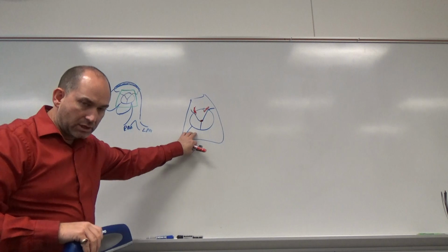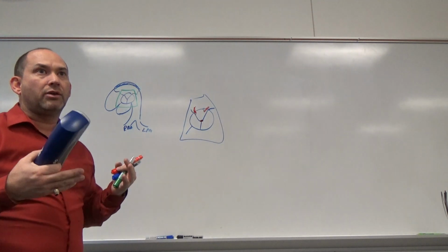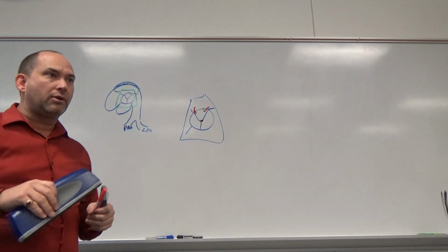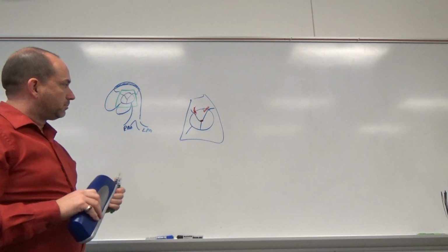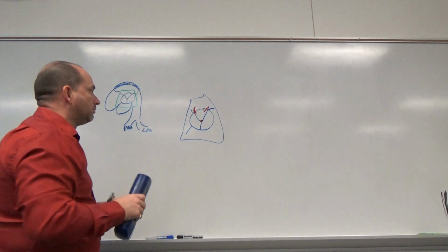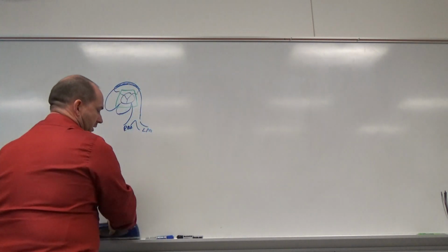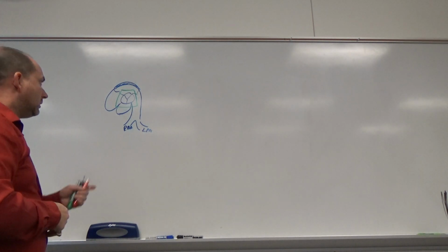So 2D clip of the aortic valve, we're looking for calcifications, thickness of valves, masses on the valves, different shapes of the valves where it's not normal. We'll talk about that next quarter, when it didn't grow properly, and we're looking for holes and stuff where they shouldn't be. Okay, 2D clip of that, and then a color clip of the color box. We don't need to do spectral Doppler because we're at a very poor Doppler angle.